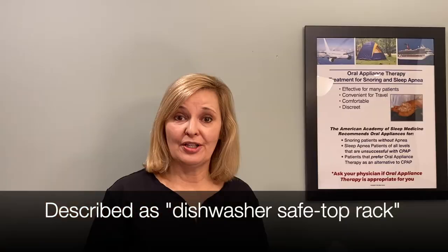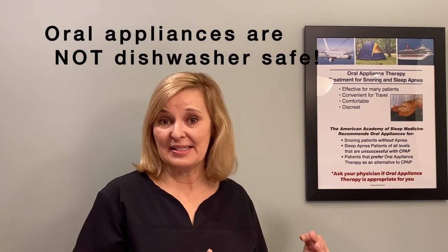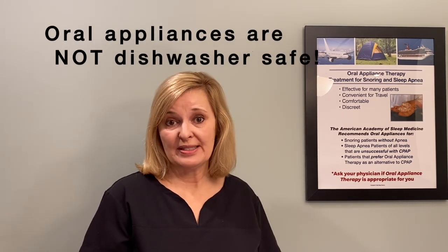I'd love to hear if any patients use a dishwasher to clean these cases — some reviews suggest people do. Just make sure you take out your device first. Devices are not safe for the dishwasher — we're only talking about certain cases that might be able to withstand it. These are basic cases for when you need a replacement or a different type for traveling or cleaning.